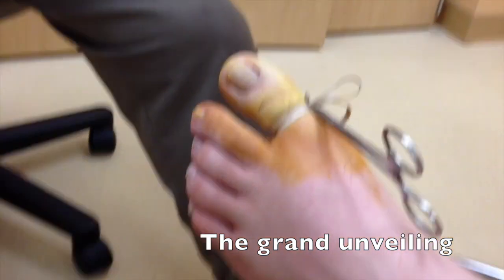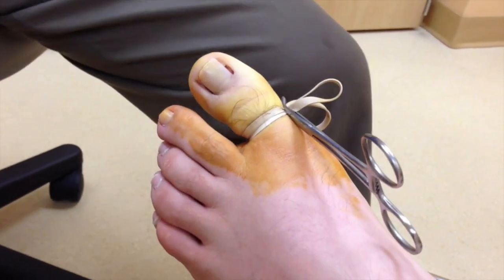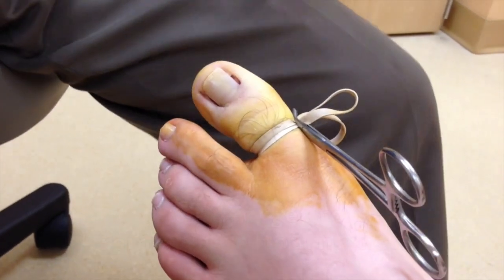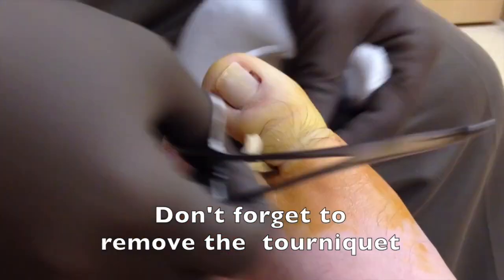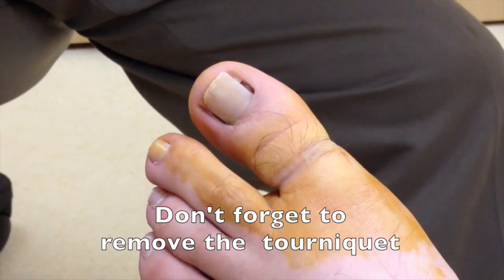And there we go. The nail looks good, and thanks to exsanguination, we have minimal bleeding.